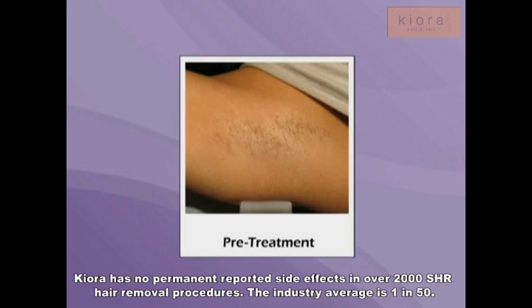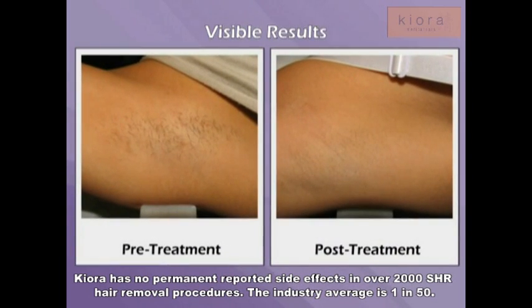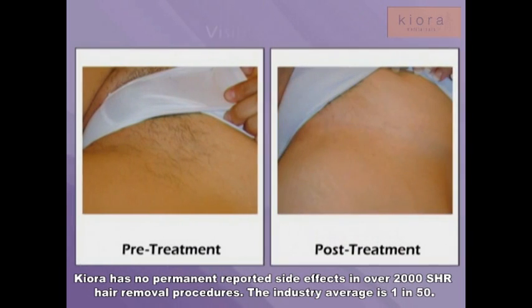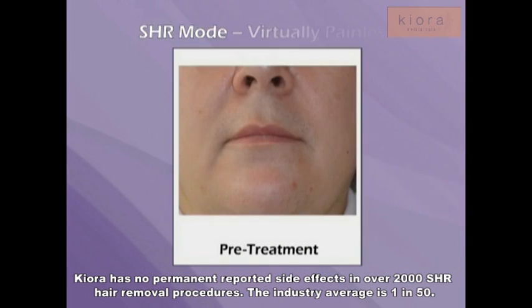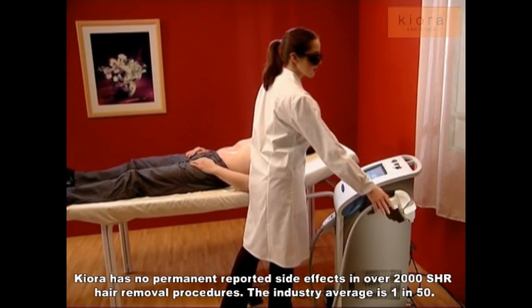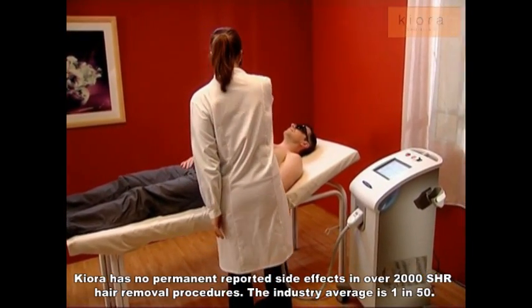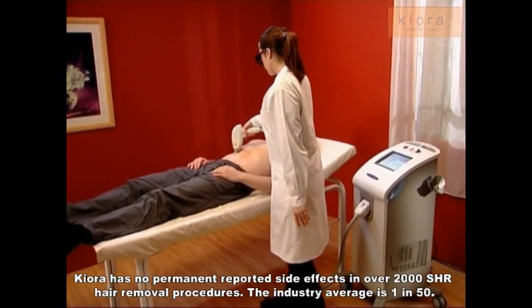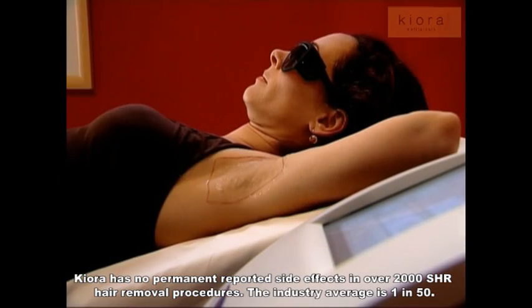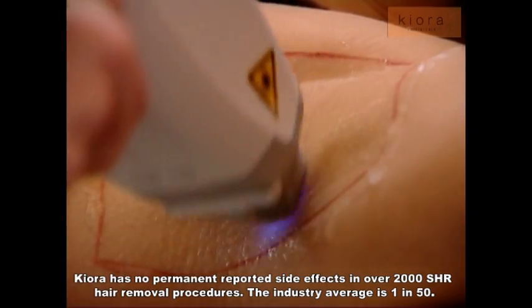Treatment with the Soprano XL diode laser hair removal system produces visible results and a high degree of patient satisfaction. With the revolutionary SHR mode, treatment is gentle and virtually painless. There is no downtime for the patient, who can resume activities immediately after treatment. We at Alma Lasers hope that you have found the Soprano XL video helpful and wish you the best of success in treating your patients with the new Soprano XL system. If you have any questions related to our product, please feel free to contact our clinical support team.